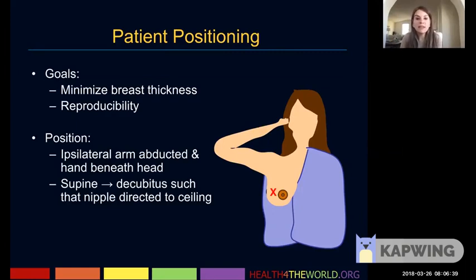But it's not very common that I will also be the same doctor coming back and doing her biopsy. So just in case you're not doing everything for that patient and your colleague or your partner or another doctor may be coming in to do the biopsy, you want to make sure that they can, without a doubt, find the same lesion that you've documented and recommended for biopsy.